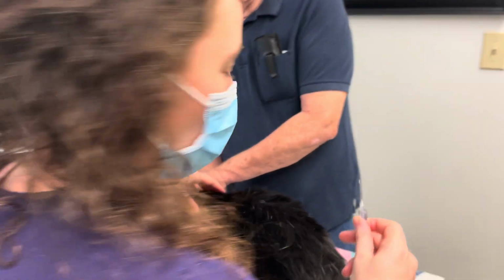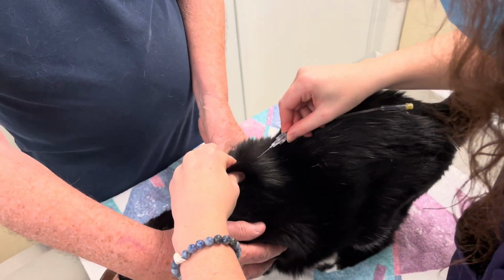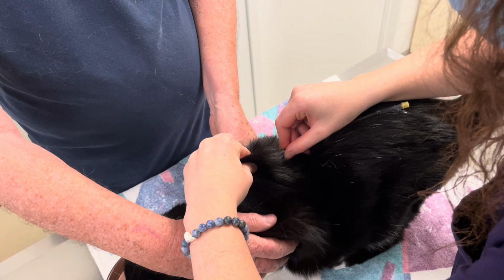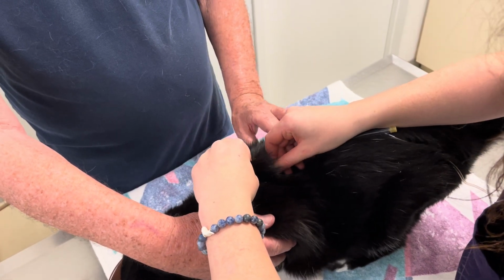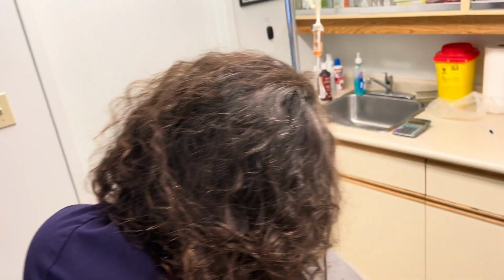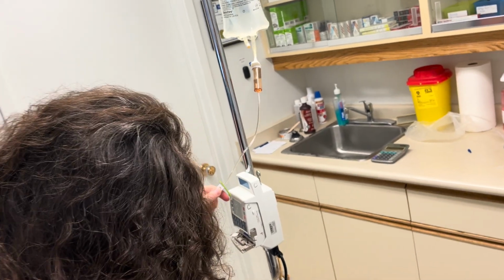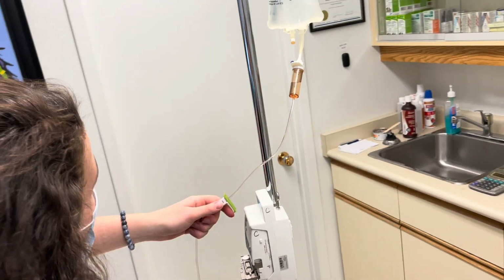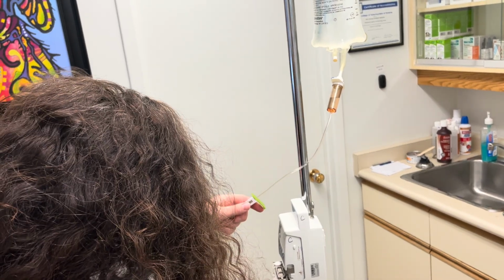And I'm going to have to lift up his skin here. So I'm going to lift up his skin. I'm going to go with this needle in between his skin here. So I need to drop that now and continue holding and then loosen this. And just put it again to about where the drip should be.